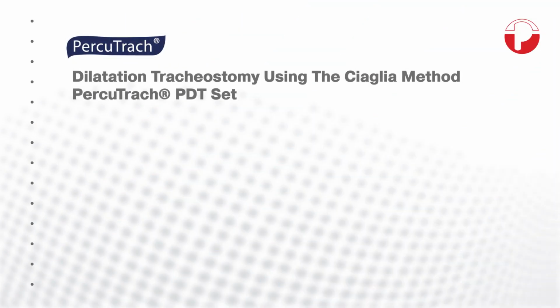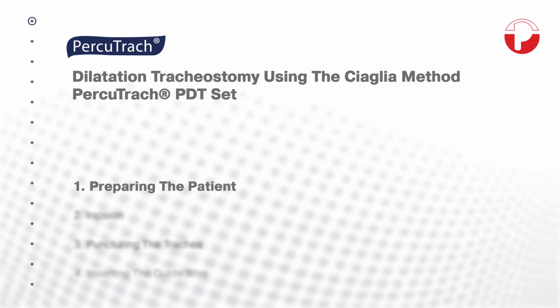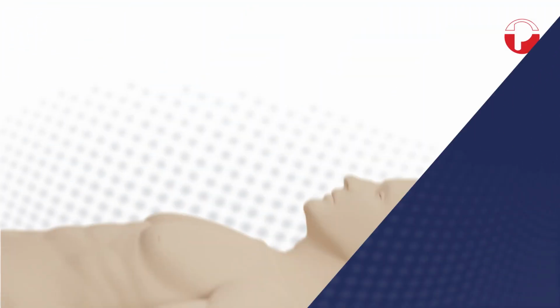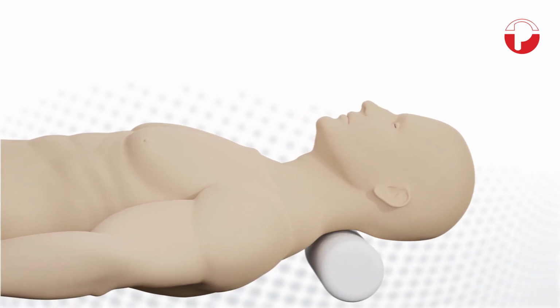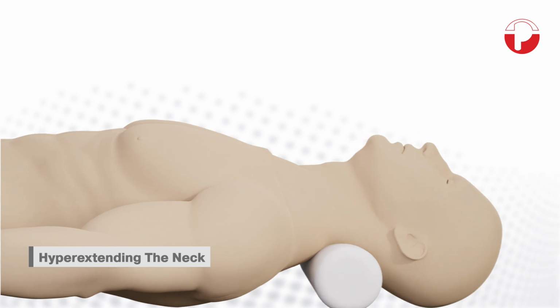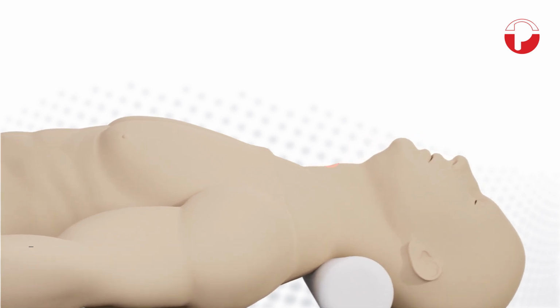To use the PercuTrach PDT set, first prepare the patient. After the patient has been sedated, place him in a supine position and support the neck and shoulders in such a way that the neck is hyperextended. An ultrasound exam of the neck region is recommended to specify the anatomical conditions.